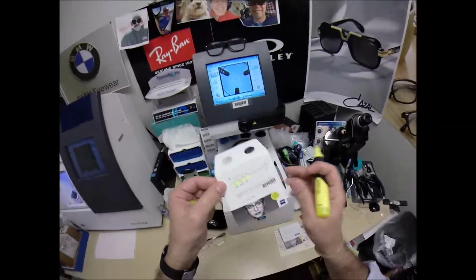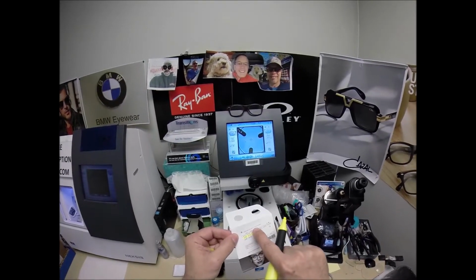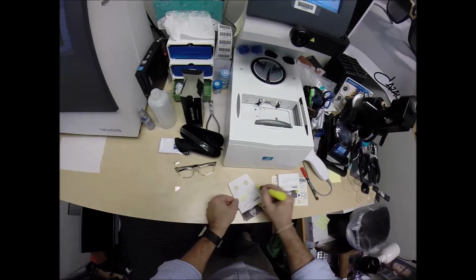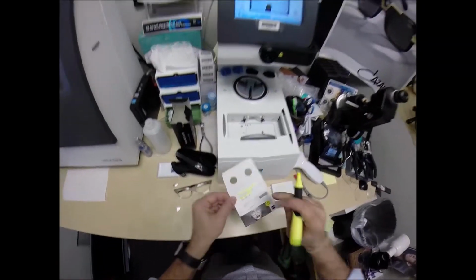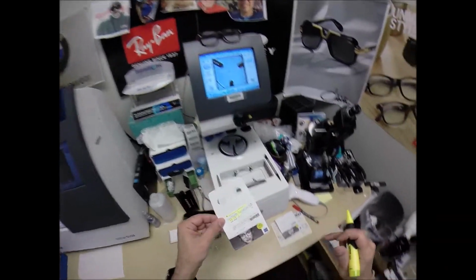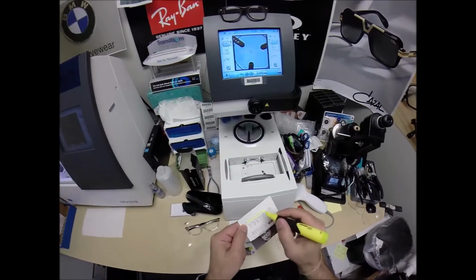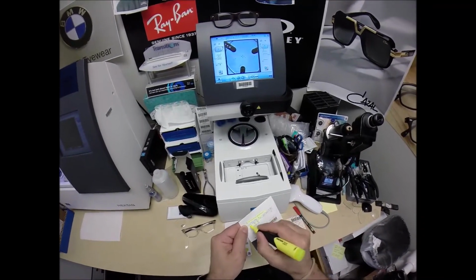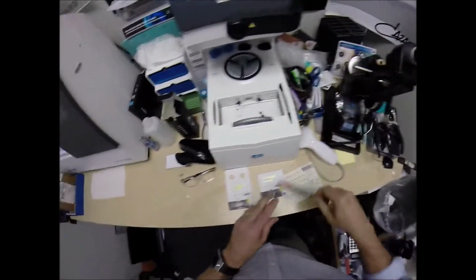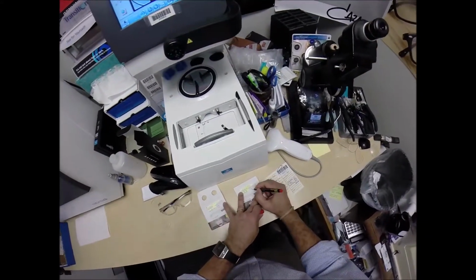Of course, you're going to make sure you get the original packets. It says Zeiss Vision Spherical 1.59 Photo Fusion Blue. Highlight that for the right lens. The DP stands for Duravision Platinum, just under that, and of course your prescription that is there. Do the same thing for the left. -1/4. And of course this is the right lens. Of course it says right, but I always like to write it on there. This is the left lens.